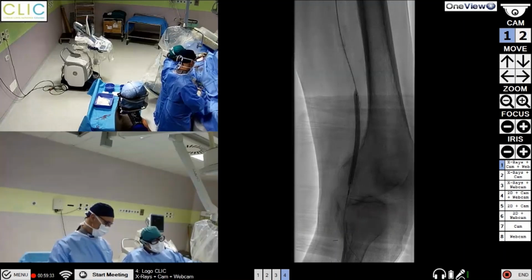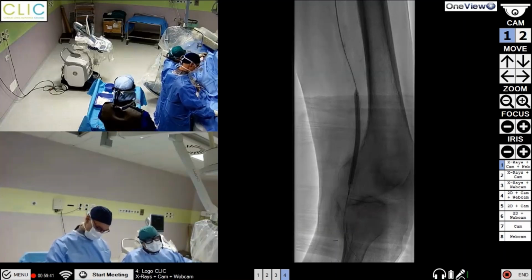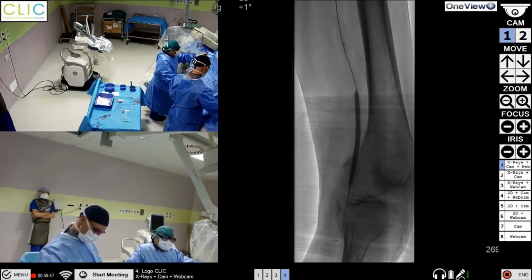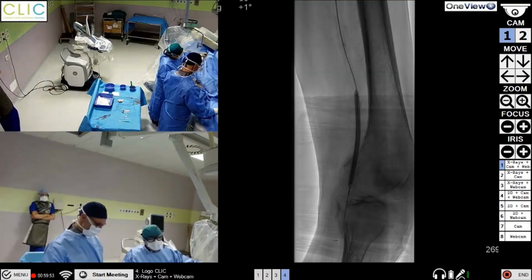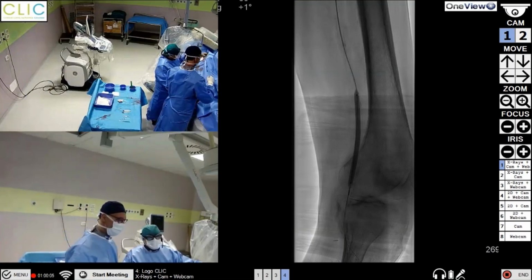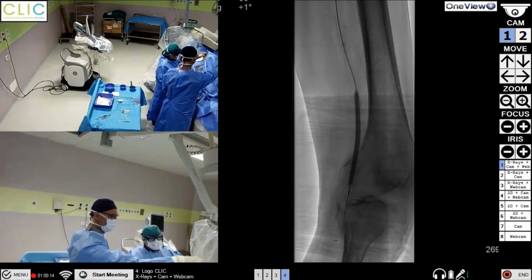Well, I'm not so sure about the atherectomy. Probably orbital atherectomy could change the compliance of the vessel in this area. I'm not sure about the distal outflow. Well, we have a very severe aspect, at least angiographic, with the desertic foot. So I'm not sure about the possibility to perform an orbital atherectomy because of the probability of distal embolization with the debris.